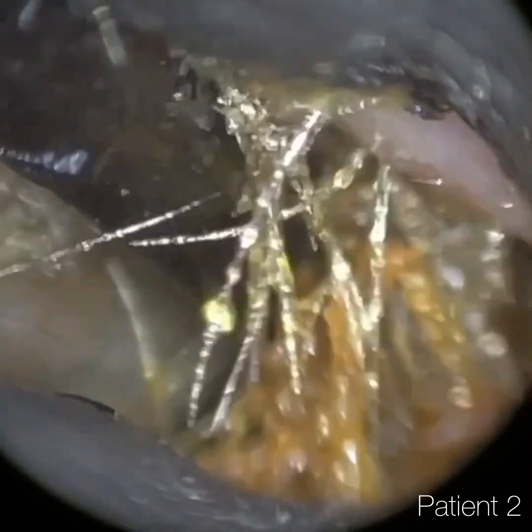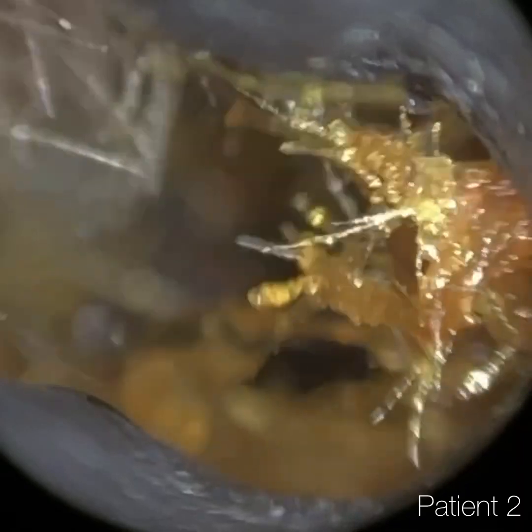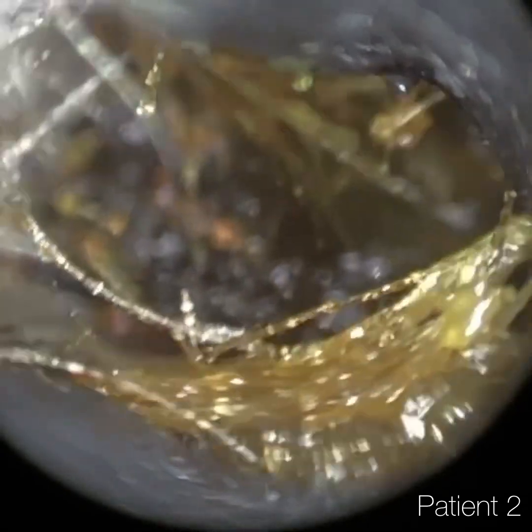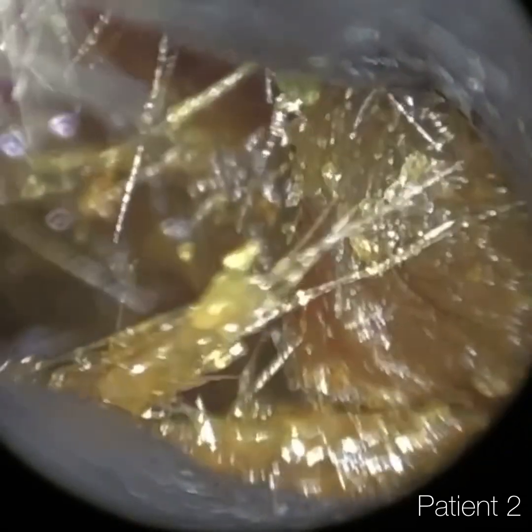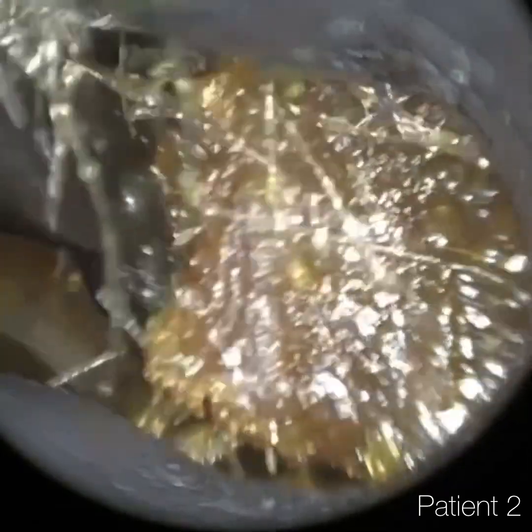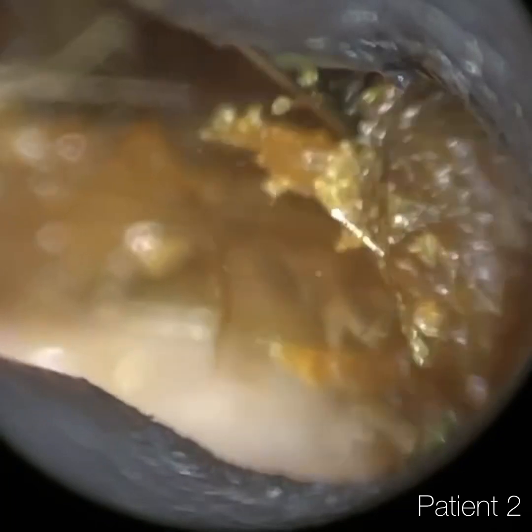So this is what's great about the Waxscope — we're able to use a full range of ENT instruments, and you'll see that in this procedure. There was a gap at the top, and because of the consistency, I just used the Jobson horn to remove some of the more lateral wax. And I'm going to go back in with the Jobson horn. You can see how easy it is to glide it in, get in and behind the wax, and slowly but surely bring this wax forward and out of the ear.